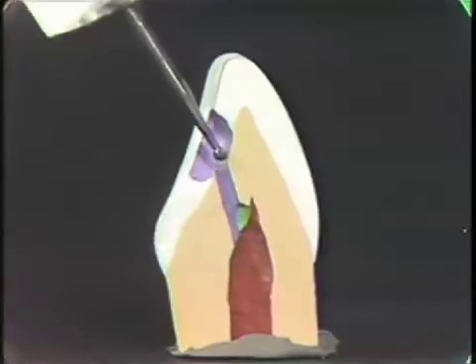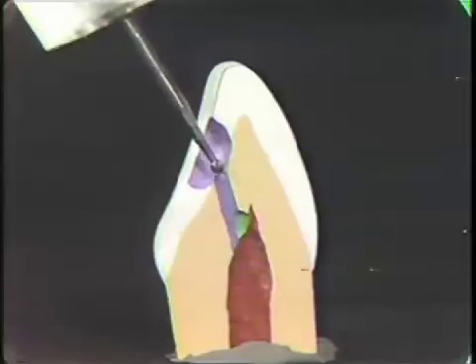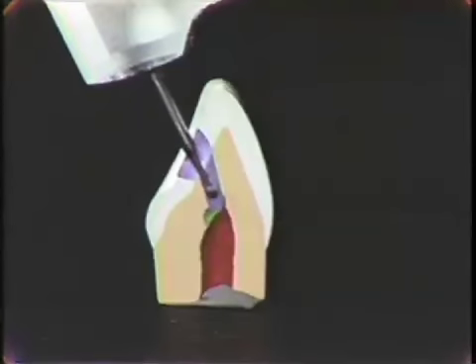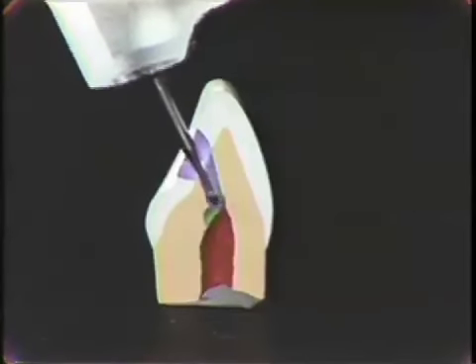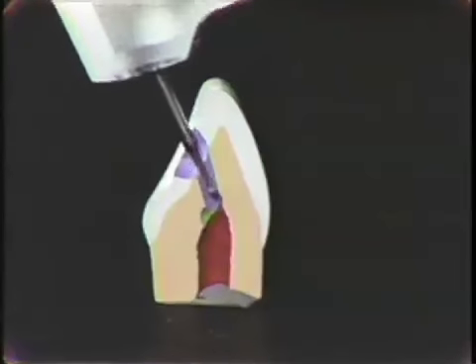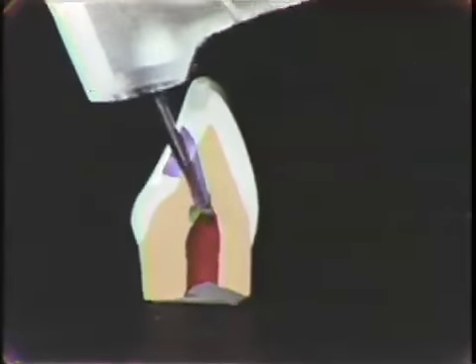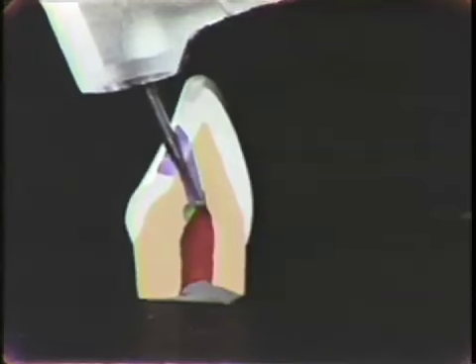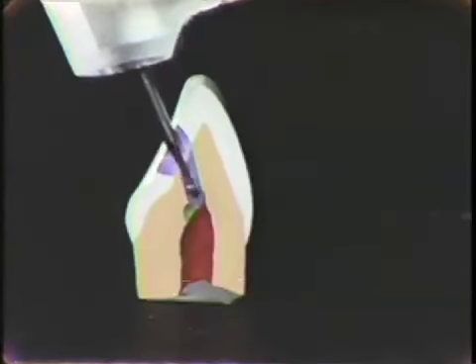Now, you won't be able to remove it in one pass, so you'll have to reinsert the burr. Feel again for the walls, keeping away from the wall of the pulp chamber, locating, in this case, the lingual roof of the pulp chamber, and once again, unroofing, working from the inside out.